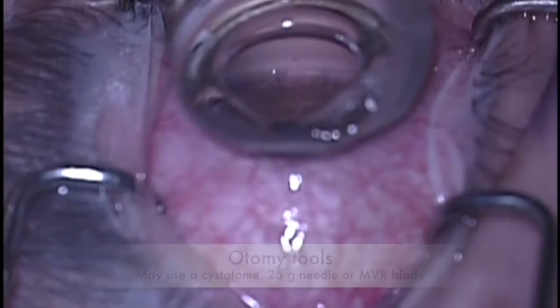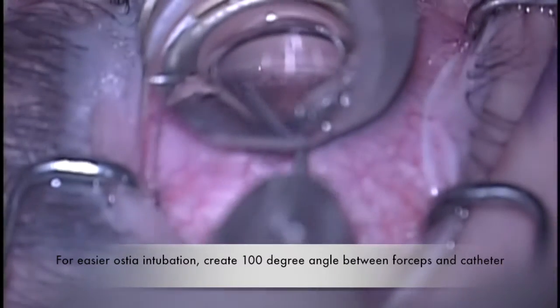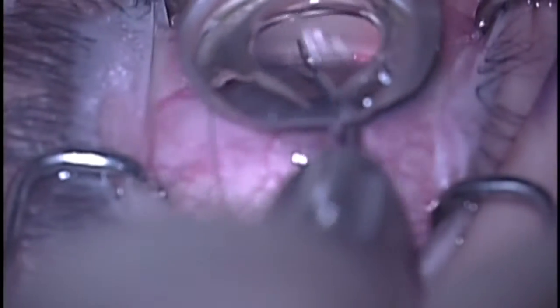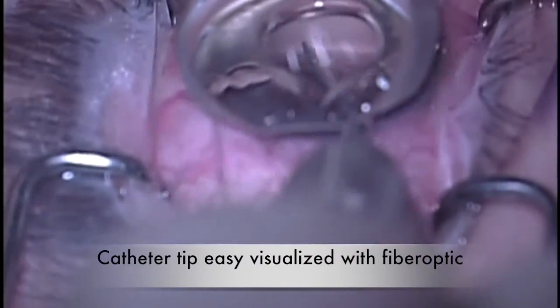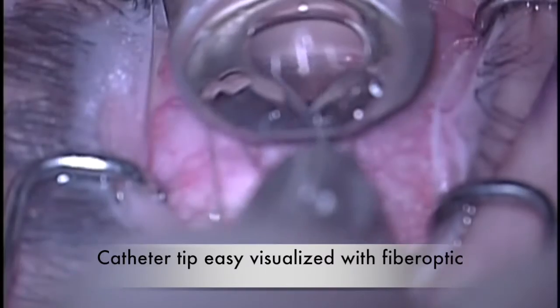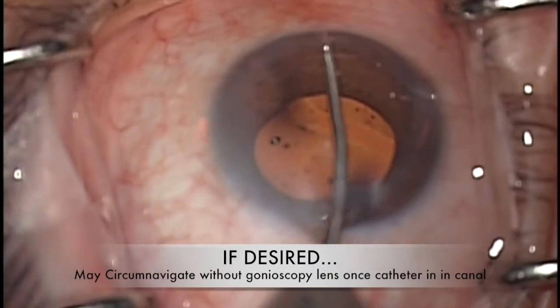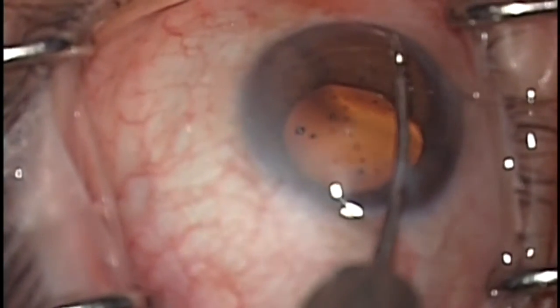The catheter is then grasped using micro forceps, and it is preferred to grasp the catheter at an oblique angle, which makes intubation of the ostia a little easier. Once in the canal, the catheter is then circumnavigated 360 degrees. Following initial intubation, some may choose to complete circumnavigation without the gonio lens by returning the patient's head to primary position.